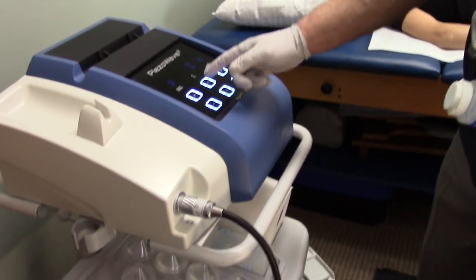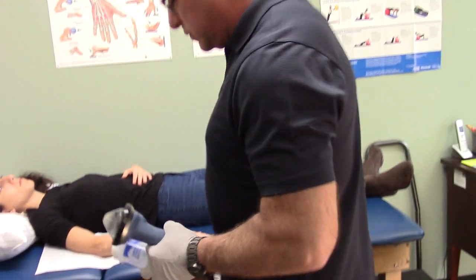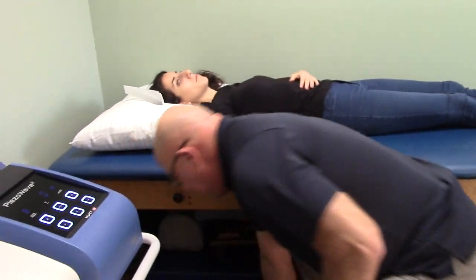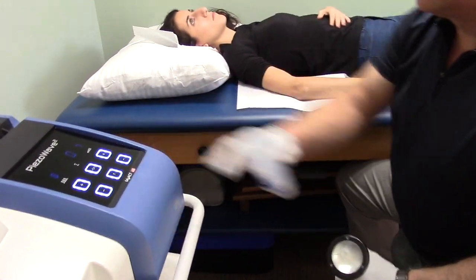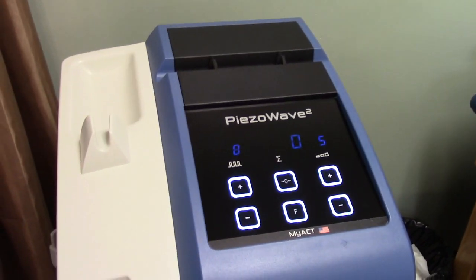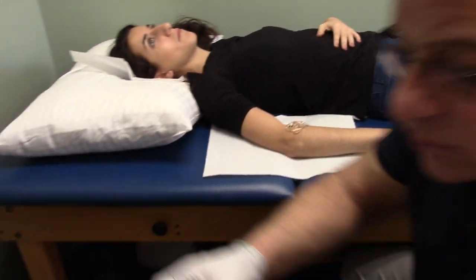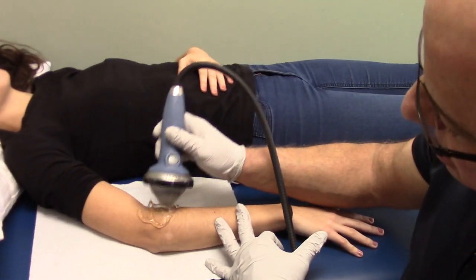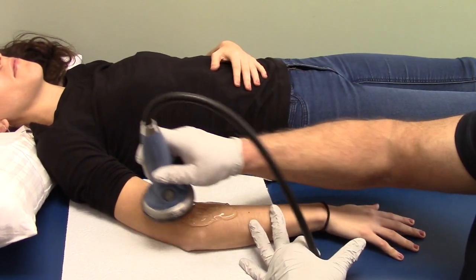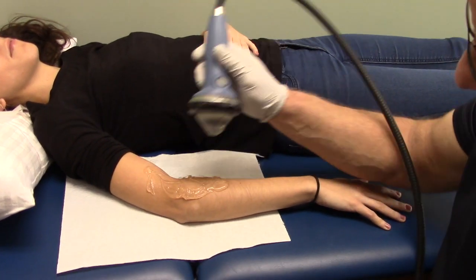The next thing I can change or modify is the number of pulses. In her case for the demonstration, we're going to do about 500 pulses to see how the unit works. We have the foot paddle over here that I can use to control the pulses, the intensity, and so on. I'm going to start her at about a five intensity. We apply the gel to the area, making sure the head applicator is directly on the area we're treating.